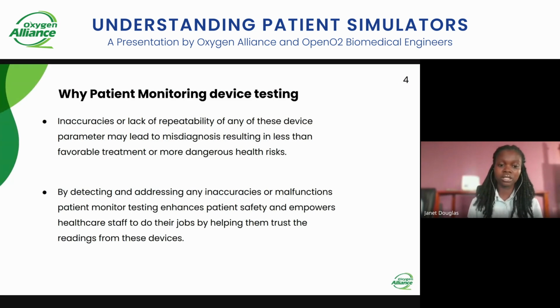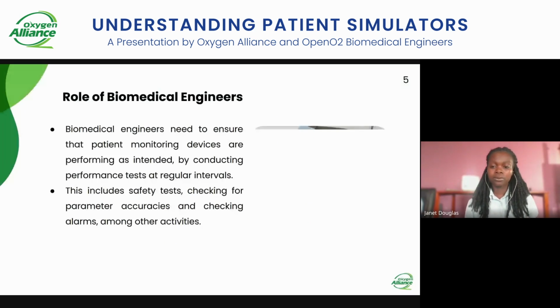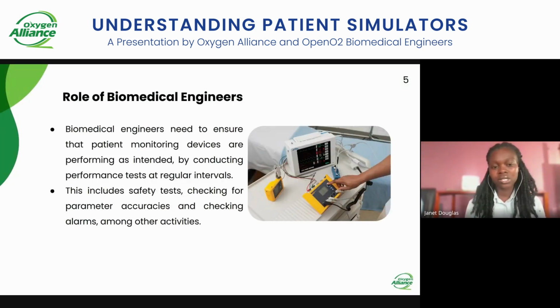It's very important because we address any inaccuracies or malfunctioning of the patient monitoring devices that you might have, either in your hospital or at any facility where you're using these devices. Now, we as biomedical engineers or biomedical technicians are supposed to take a step forward. When you're planning your preventive maintenance, you also have to consider checking the performance of these devices. We are supposed to be conducting performance tests at regular intervals.